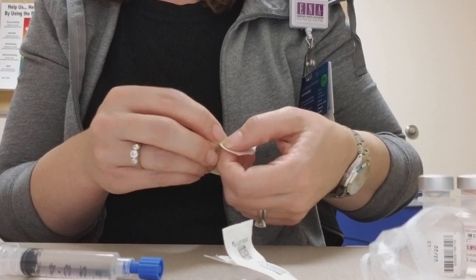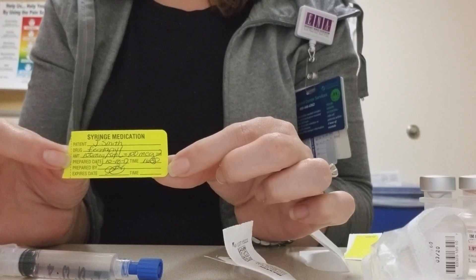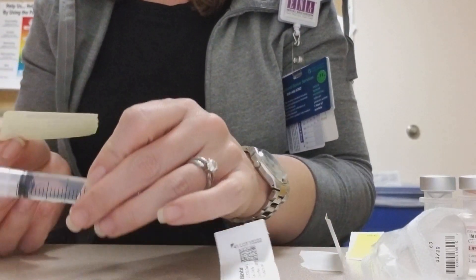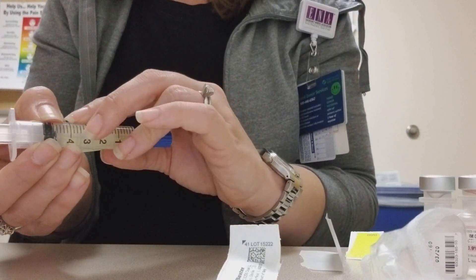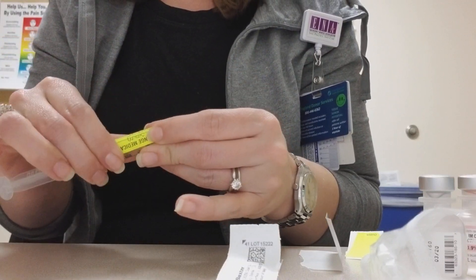I'm going to use one of my syringe medication labels. So I'm going to put my patient's name on it, the medication that I'm giving, the ratio that it's diluted into, the date, and my initials. So if I hand this off to anyone, they'll know exactly what's in this tube.